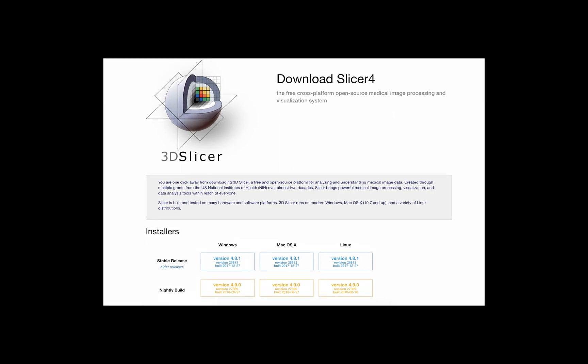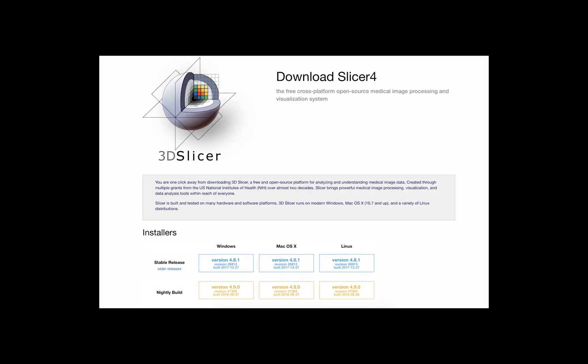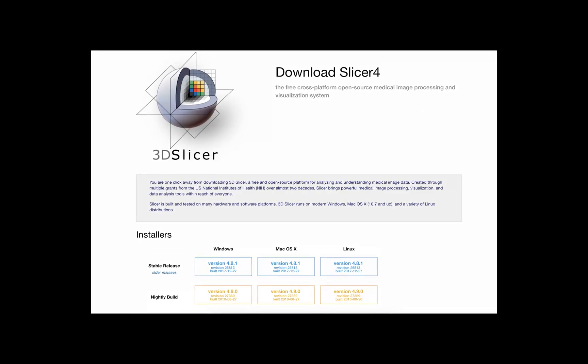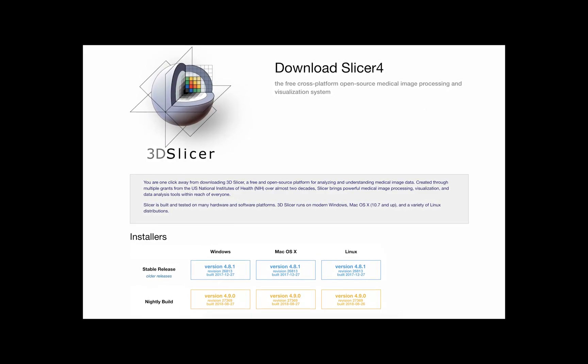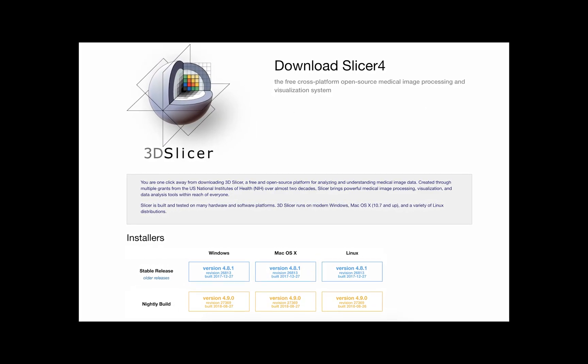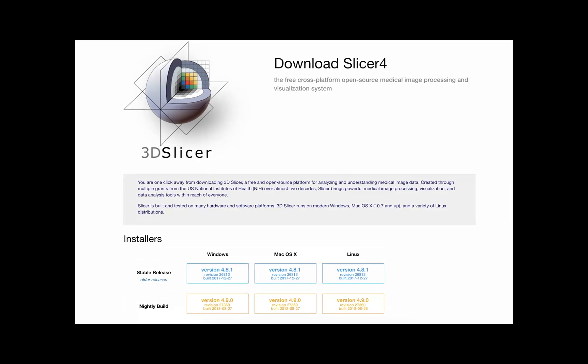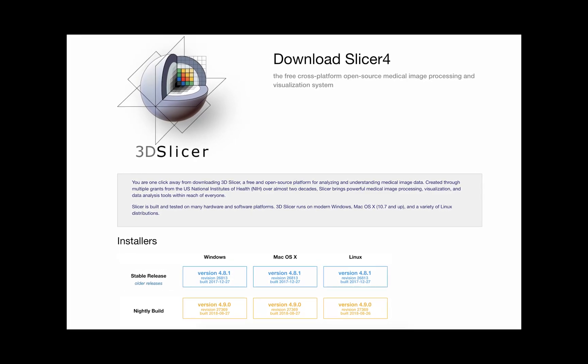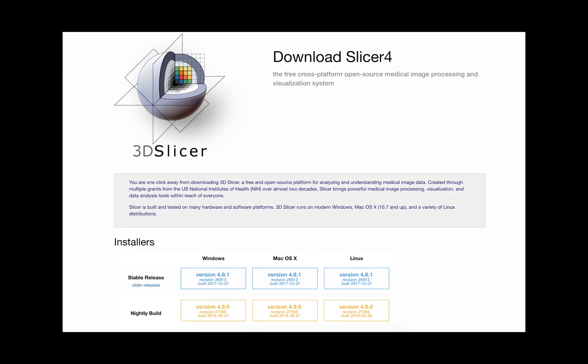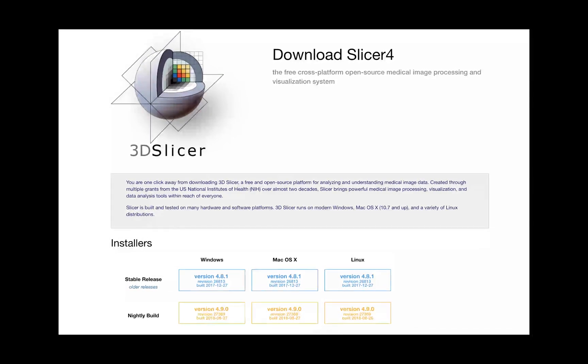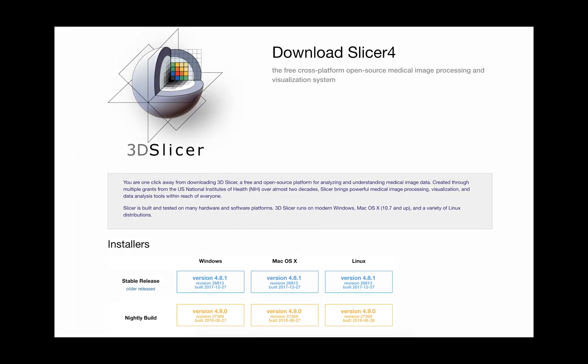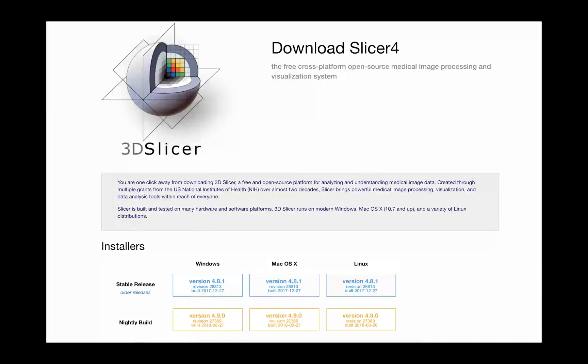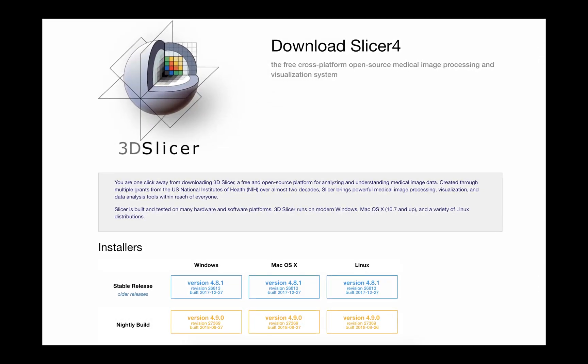This video will cover installation and usage. In this example, we are using 3D Slicer version 4.9. Please note that the tools are available for several versions of 3D Slicer. Please use the Extension Manager to check availability for the version of 3D Slicer that you would like to use.